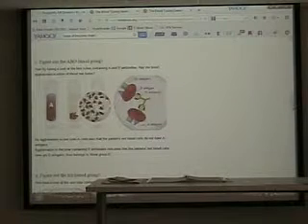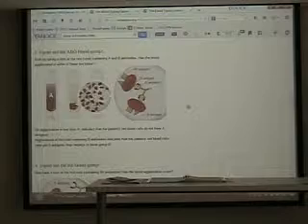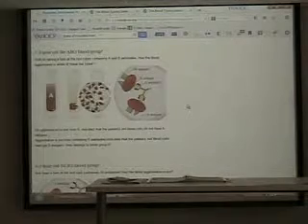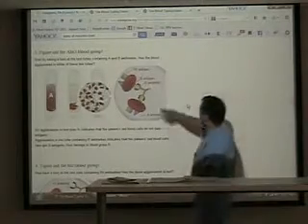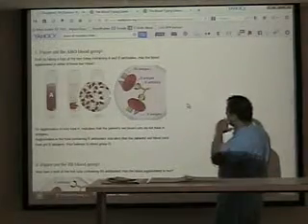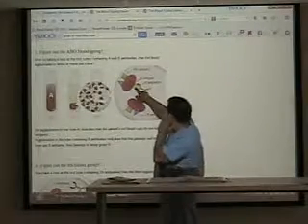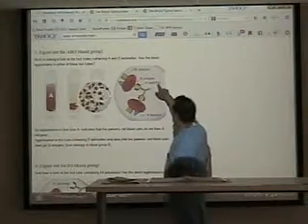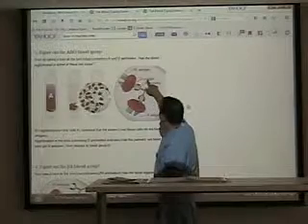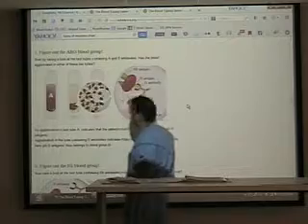Okay? And here's a further explanation of what's going on. Because this is what's going on right now in Tube B. Tube B was originally full of these B antibodies. And then I have a patient who has B antigens present. So that antibody will attack this B antigen, and guess what? There'll be clumping, there'll be a reaction, and that's where you get the agglutination.